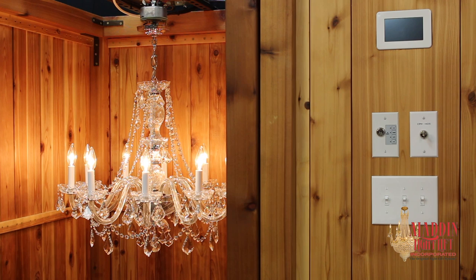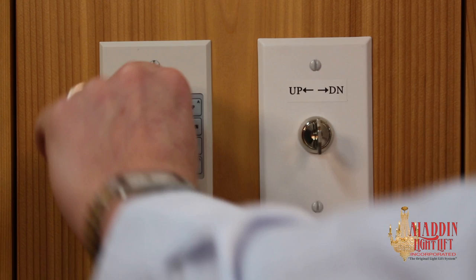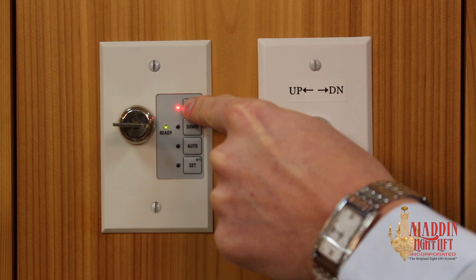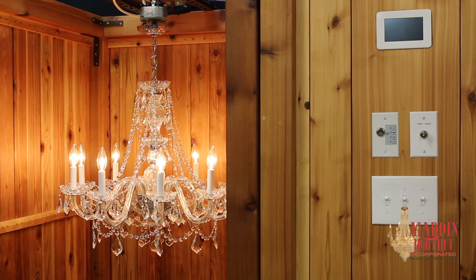The Smart Lift Controller can be used in manual mode. Insert the key and turn the controller on. Press down to run the lift down; release the button at any time to stop the lift. Press and hold up to run the lift up. It will automatically shut off at the ceiling position.